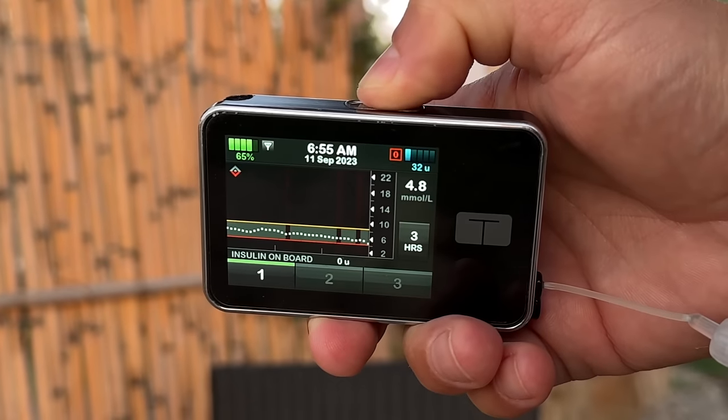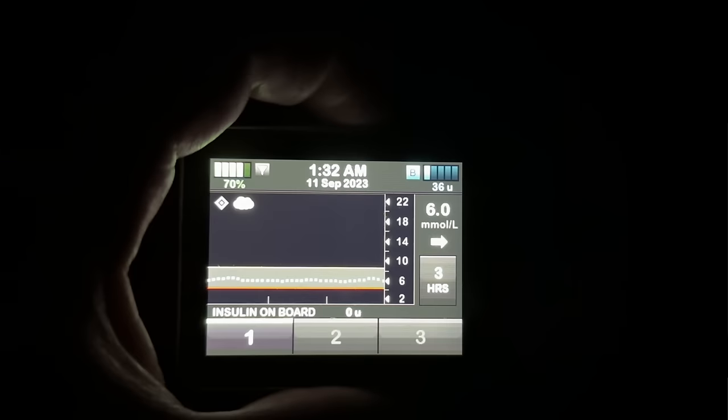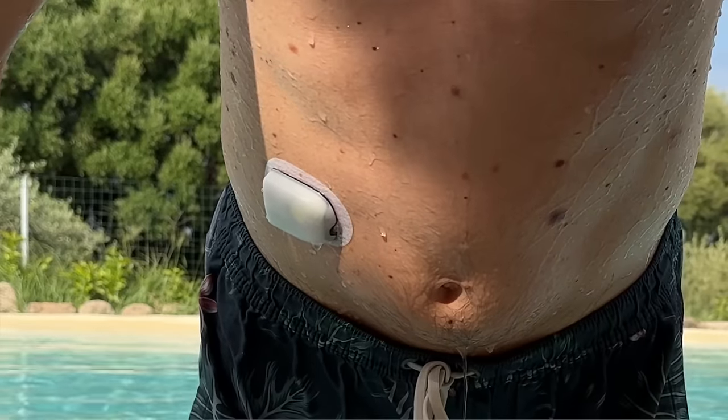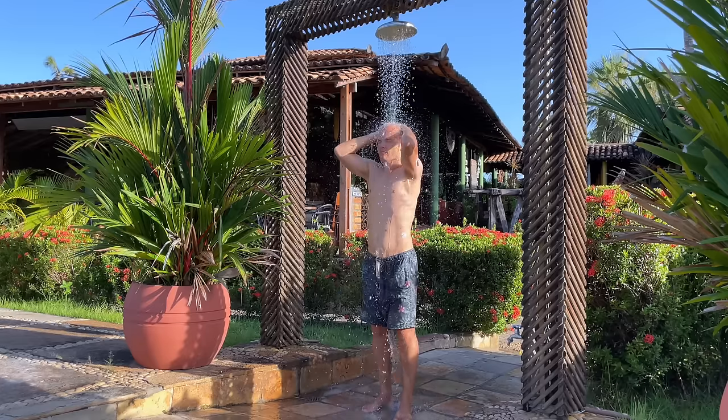One little thing I loved about the T-Slim and really missed when I switched to Omnipod was the screen light. Anytime I woke up in the middle of the night in complete darkness, I always had the pump screen light to easily find my way to the bathroom without waking anyone up — it's the little things. On the other hand, the overall freedom of movement with the Omnipod is amazing. Not being hooked up with a tube and moving freely during sports and all kinds of other activities is such a freeing experience.